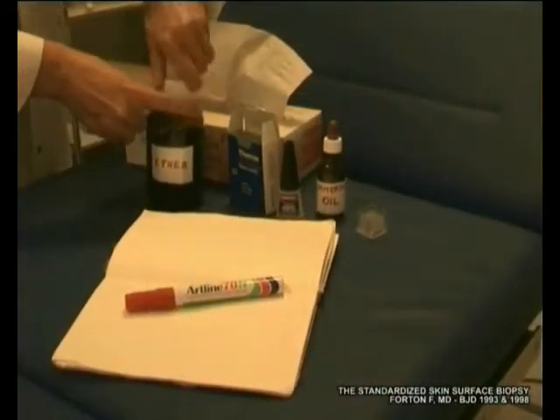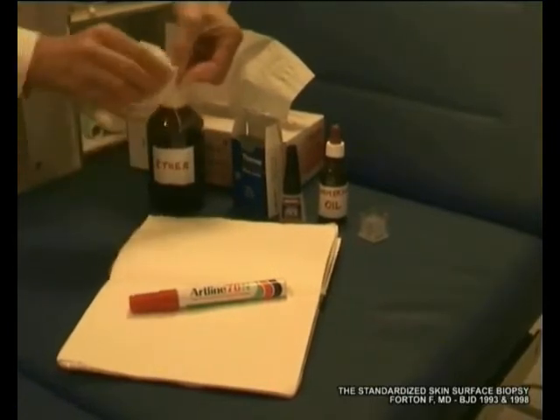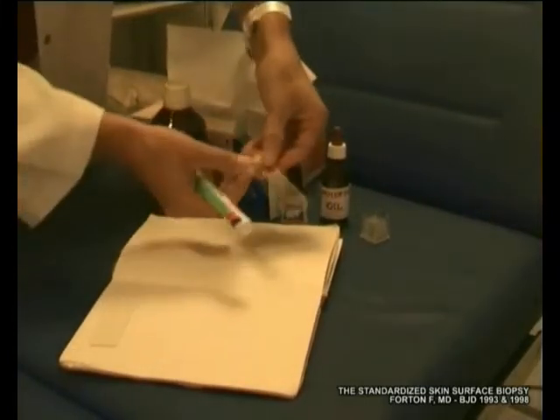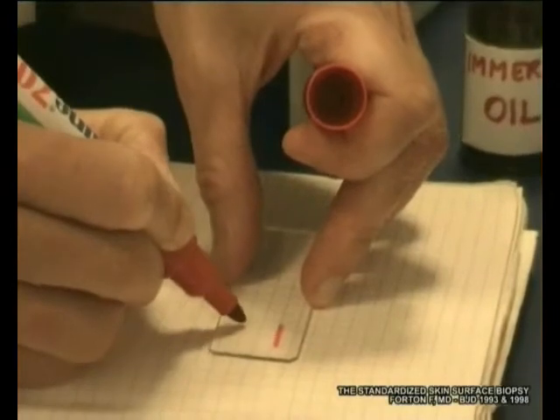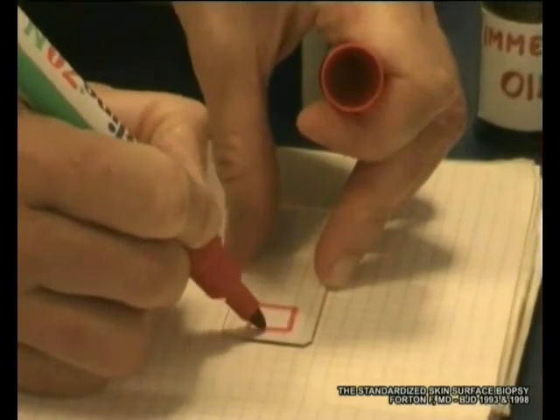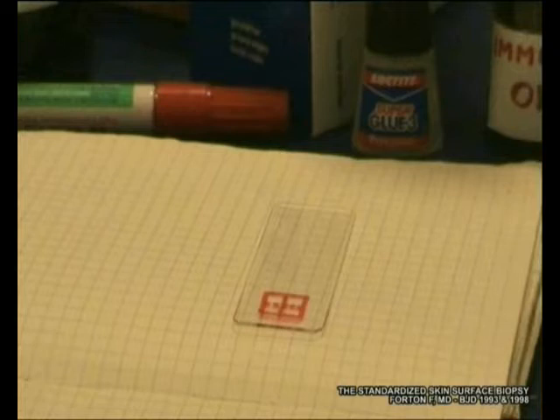Then with another paper handkerchief, we clean two slides with ether. We take two lamina because we perform two biopsies successively at the same place. We put down each of the lamina on a sheet of standard square paper, and with a waterproof pen we draw a standard surface area of 1 cm² on the lamina, tracing by transparency on the paper. The analyzed surface is then standardized for 1 cm² and is called the standardized skin surface biopsy.